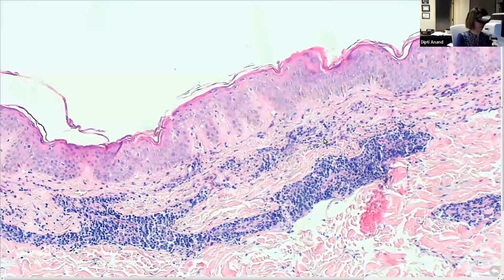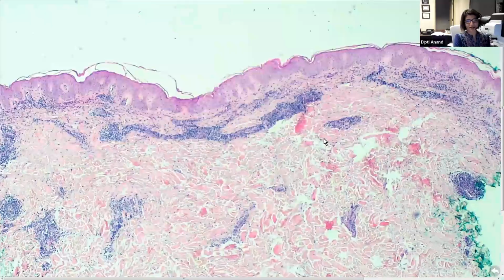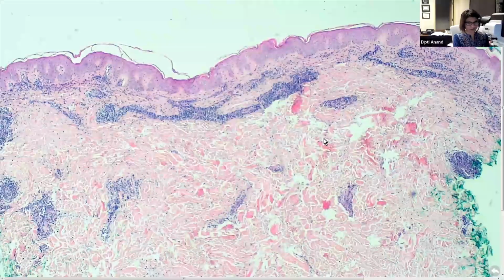So it's not lichen striatus. And it's not lichen striatus for another reason, which I will talk about later. Okay, so now lichen striatus is out. Why is this not PLEVA? It's not dirty enough, and for the same reason, the epidermis is unaffected. And for the same reason, why is this not discoid lupus?